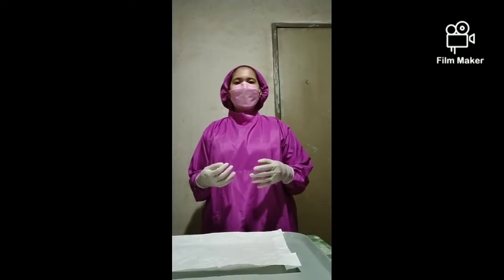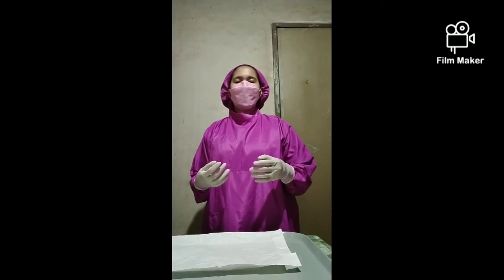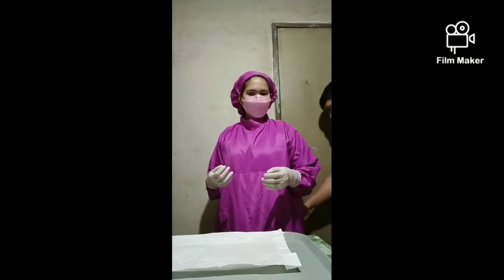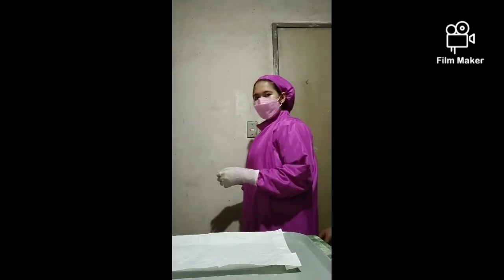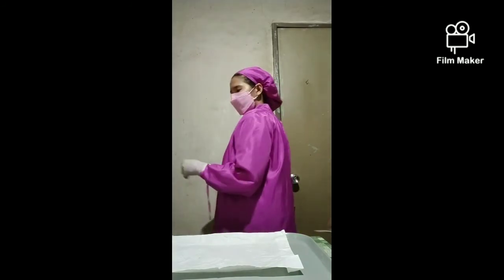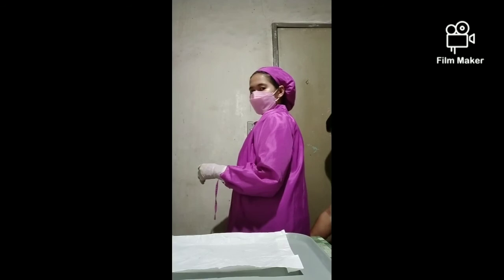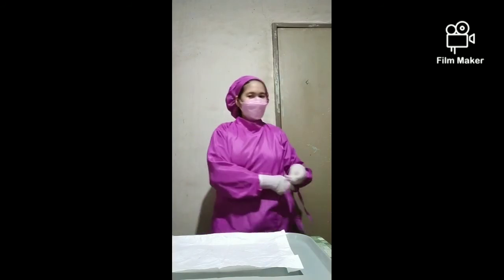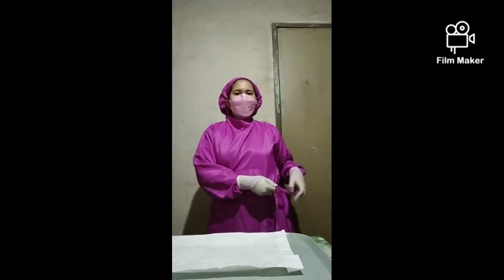Untie the ties. Keep the sterile gown fit in place and tell the circulating nurse if you are not comfortable. Hold the ends above the waist. Hold the shorter tie in the other hand. Hold the shorter tie, and ask for assistance to grasp it with sterile forceps. Then turn around. Wrap the gown around you.